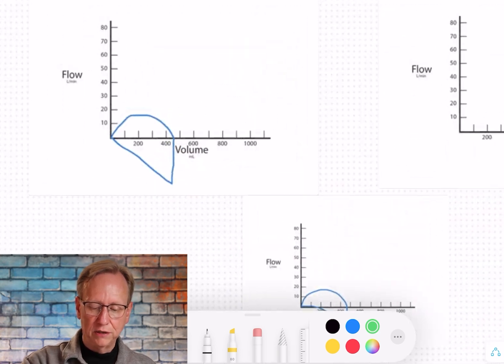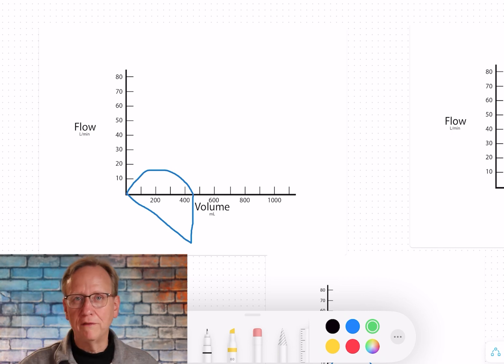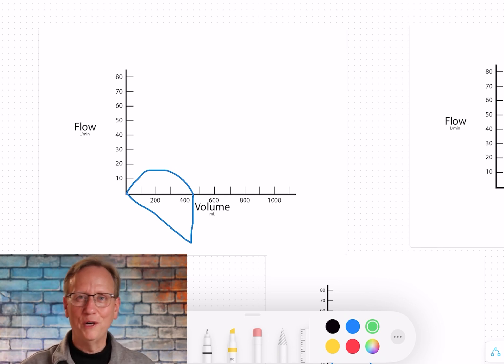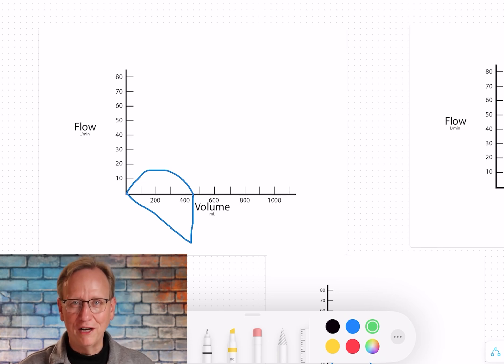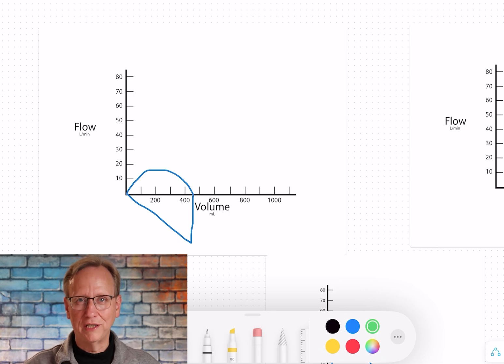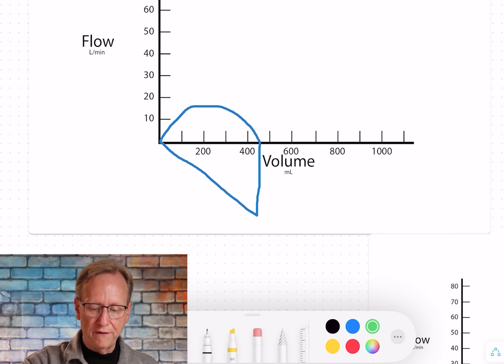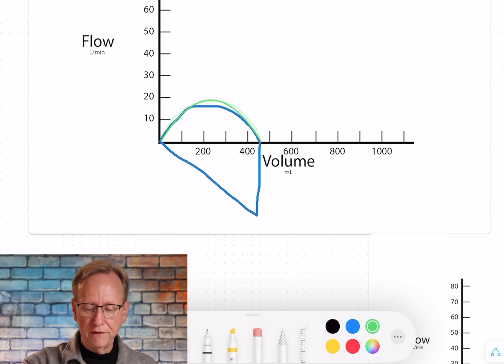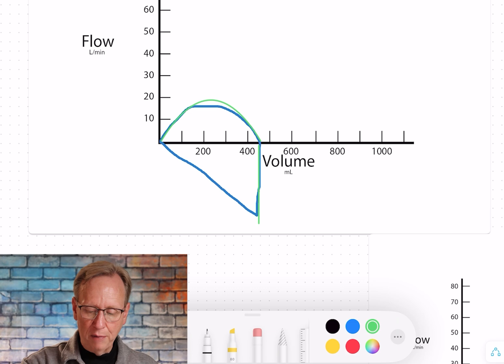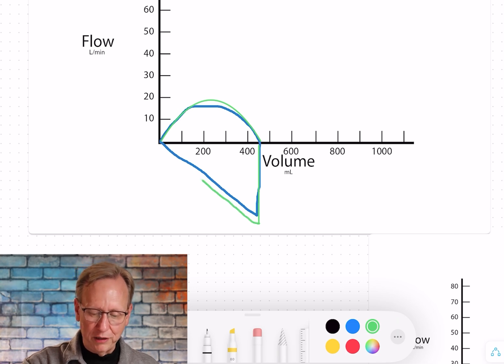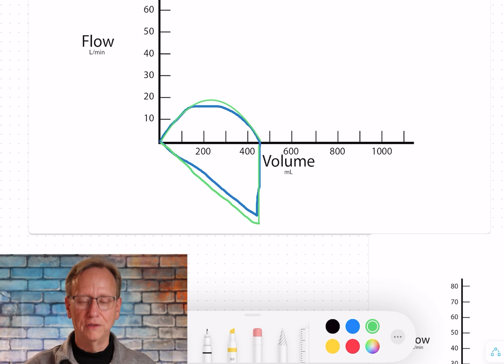This first one is called a flow-volume loop — you may have heard of that in pulmonary function testing. We can track the same thing when looking at somebody on a ventilator. Inhalation goes up here, the breath is delivered, flow eventually stops, then flow reverses and goes out until the patient finishes exhaling. When done breathing out, flow stops completely, and you get a straight line back to the zero point to finish the circle. That's what a normal flow-volume loop looks like.